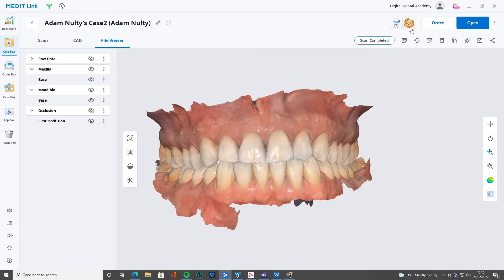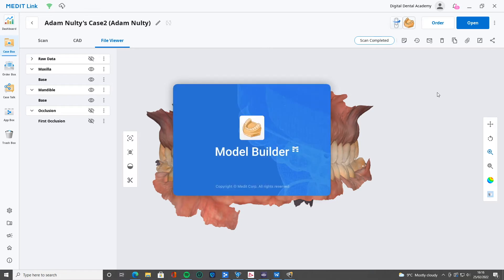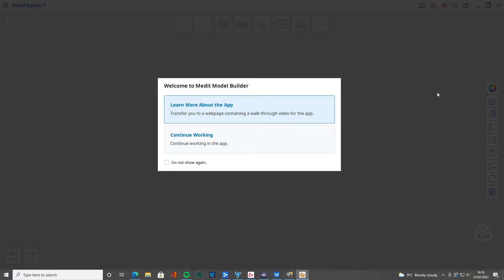Now, with any of these apps, the nice thing is that there's always little tutorials and walkthroughs that you can go through. Obviously I've gone through it, so I'm going to click 'do not show again.' But if you're unsure of anything at any point, then you can go through that.